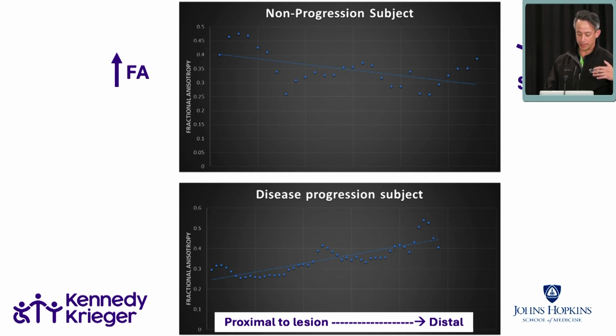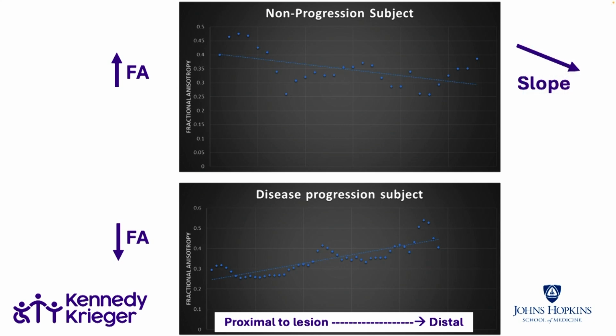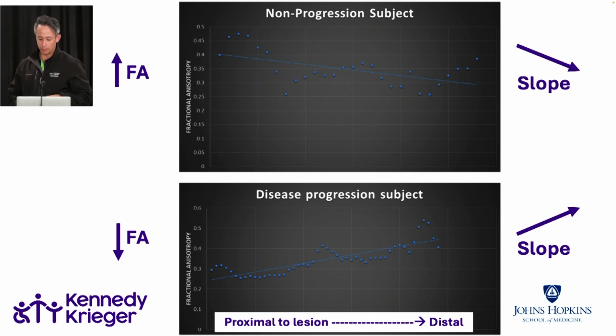Conversely, if you are a patient who has active demyelination, the FA value in and around the lesion is actually lower because there's edema in there, there's swelling, water's moving in more directions than it usually would if it was just restricted to normal myelin. So we're positing that, and we see this relationship amongst pretty much all of the subjects that we tested.